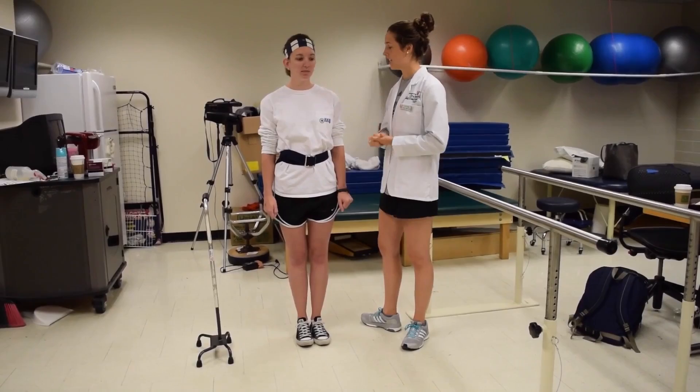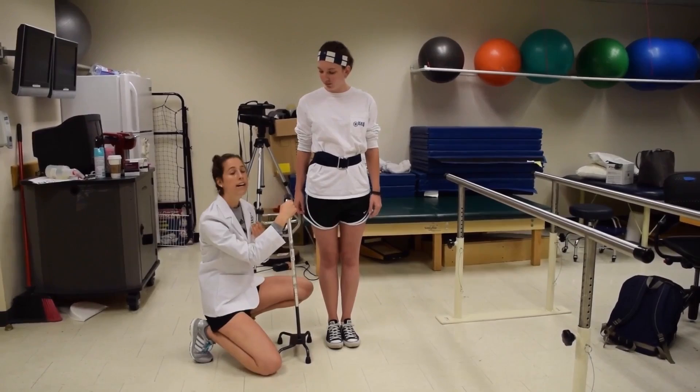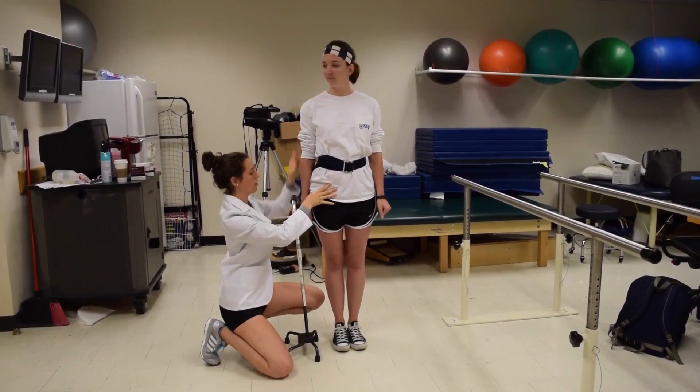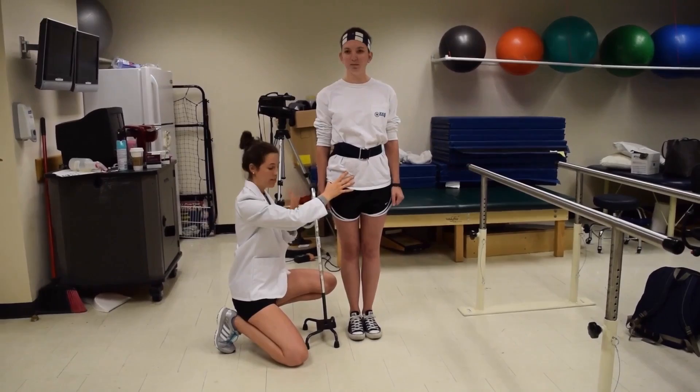The fit of a cane is very similar to that of the parallel bars. Again, we're going to line this up with Courtney's hips — even a little further down. I'm going to find her greater trochanter, and with her arm relaxed straight down, standing straight up, we look at that wrist crease. They're kind of one lower than the other, so I tried to find a point about halfway between to fit her with this cane.